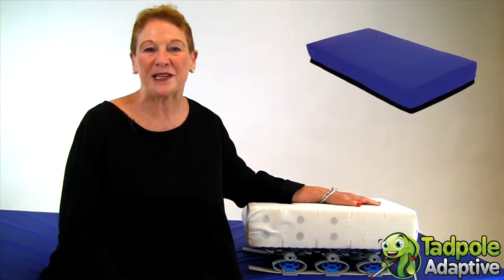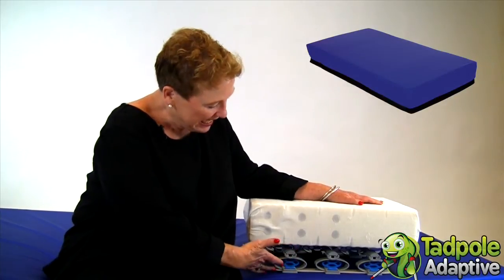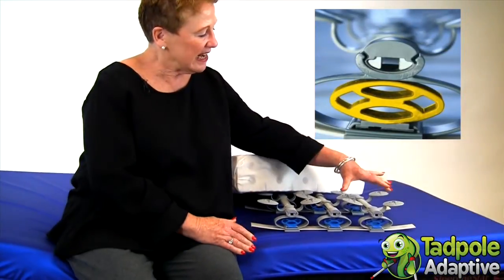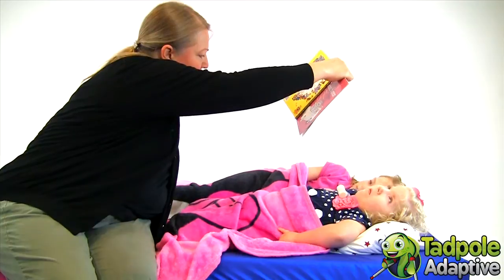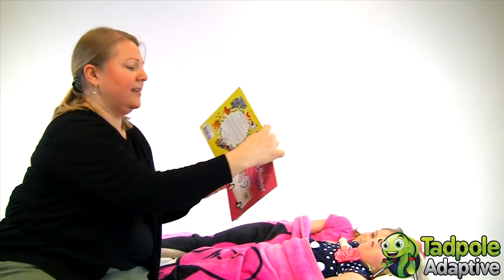My name is B.L. Meyer. I'm the founder and manager of Thomas Hilfen North America. I'm happy to be introducing you to Sleeping Star. Sleeping Star is a mattress with an integrated suspension system that reacts to a child's natural movement when you're trying to get them to sleep. It's very well documented that children with disabilities have a difficult time sleeping at night.